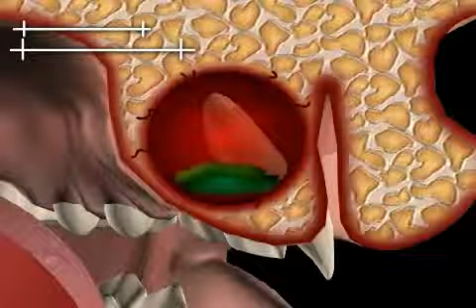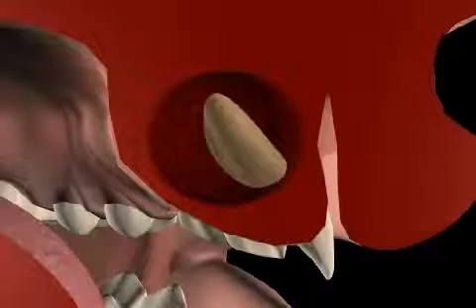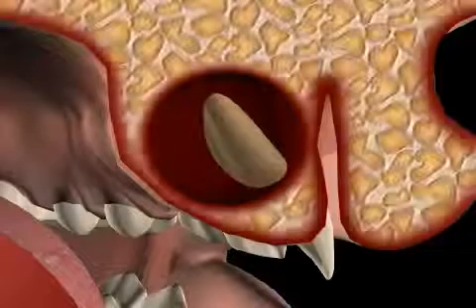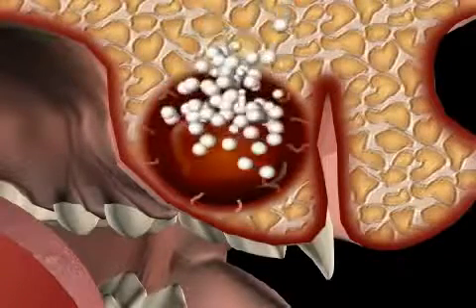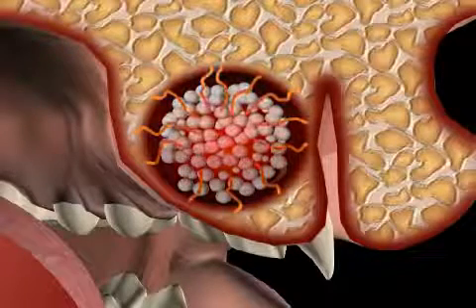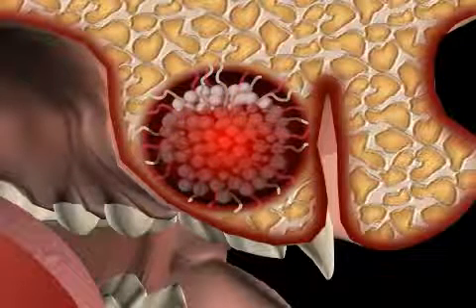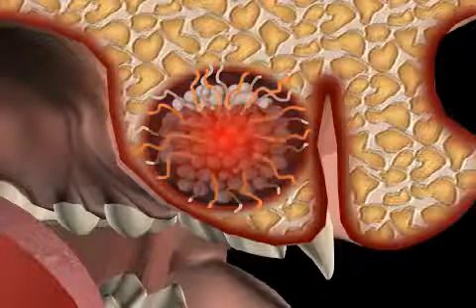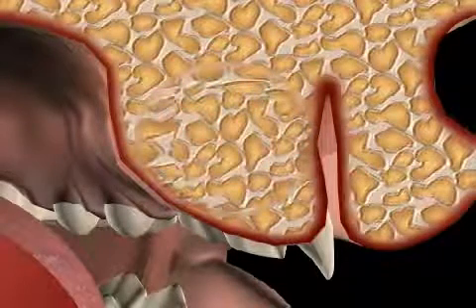In order to avoid this complication in the case of large cysts, it's common to try and stabilize the coagulated blood and to reduce its contraction, for example by filling the hole in the bone with a granulate made up of bone replacement material, as can be seen here. In this way, a contraction of the clot is inhibited, blood vessels can grow in from the walls, and the foundation has been laid for the subsequent regeneration of the bone.